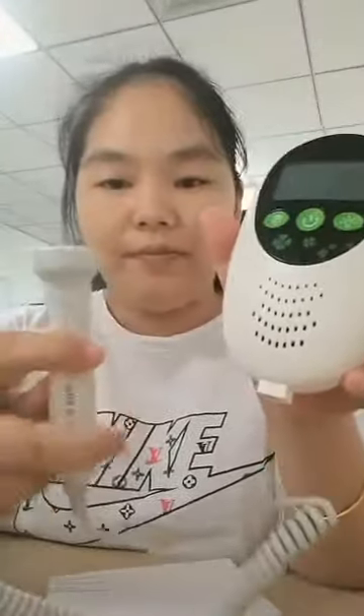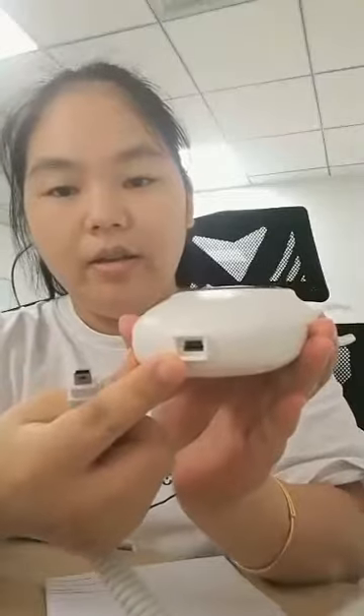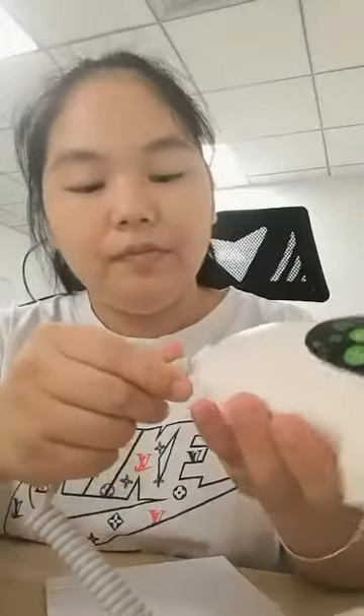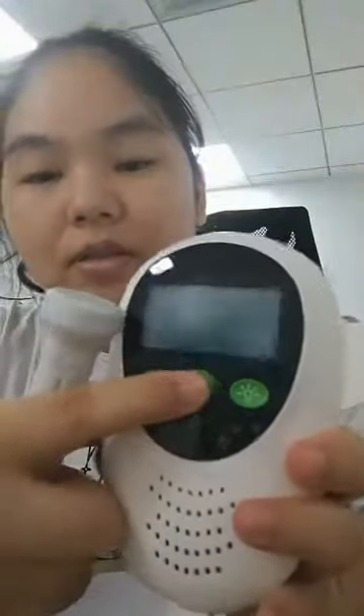Insert the probe and link it to the device. Plug in here. And press the power button to turn on the device.